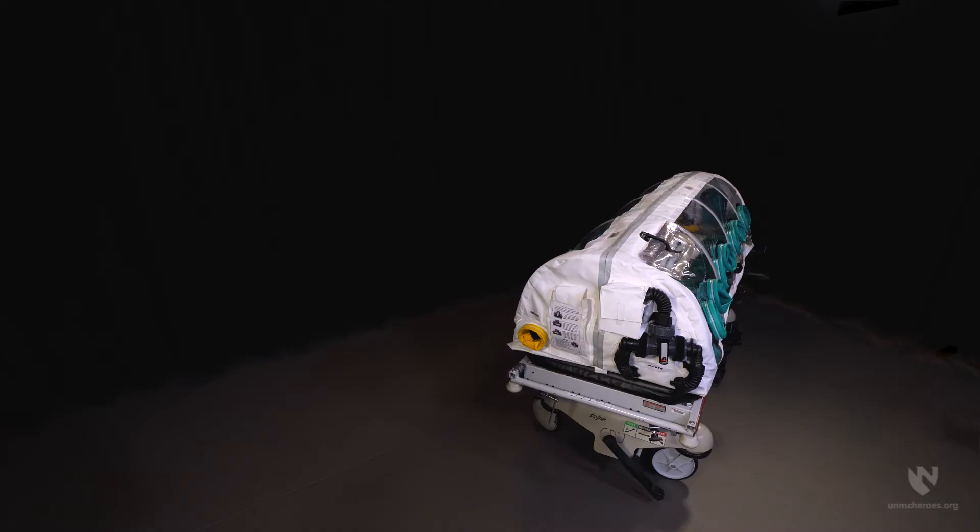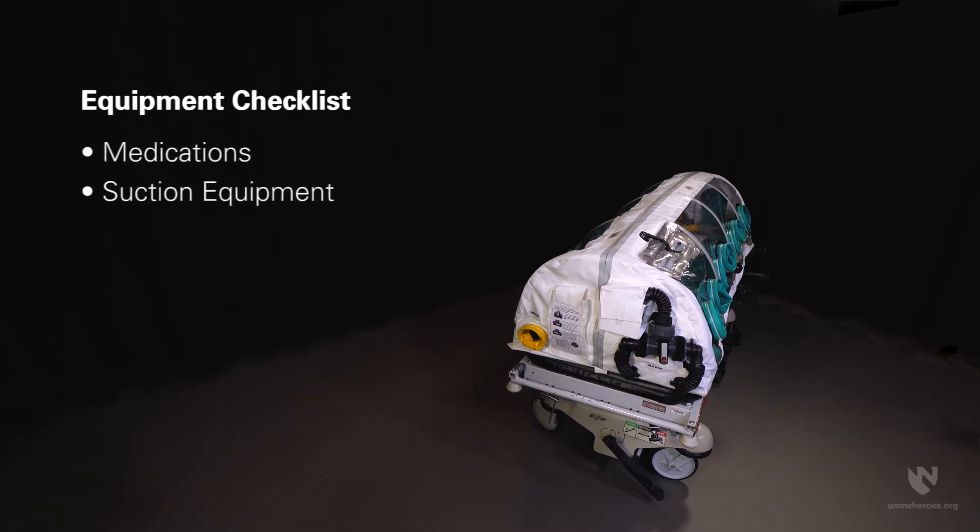Ideally, all items anticipated for providing care would be placed in the unit before the patient is loaded. Consider developing a checklist to include items such as medications, suction equipment, IV lines, emesis bags, spill kits, etc., to aid in identifying what you might need.